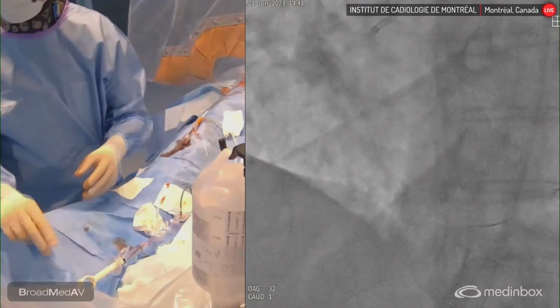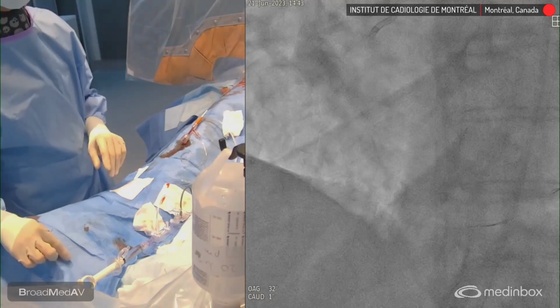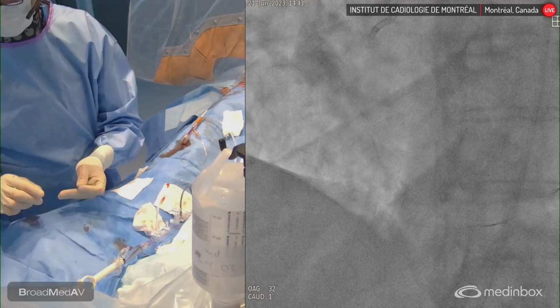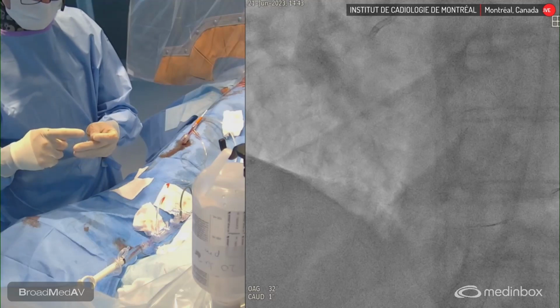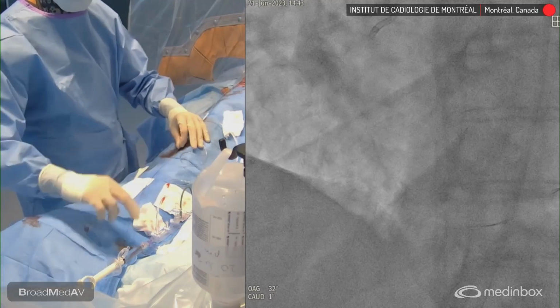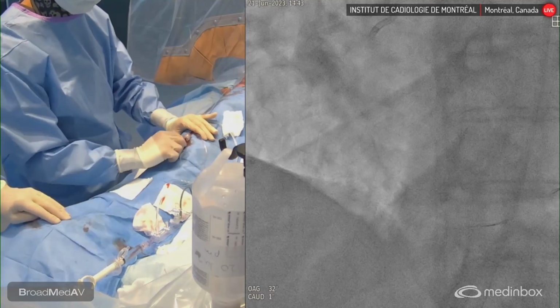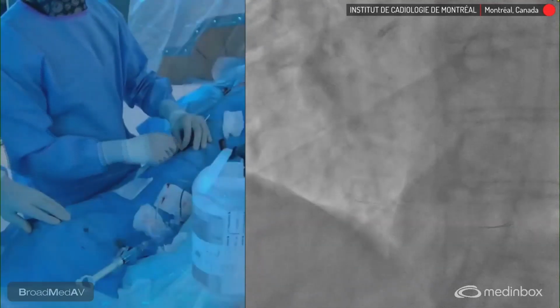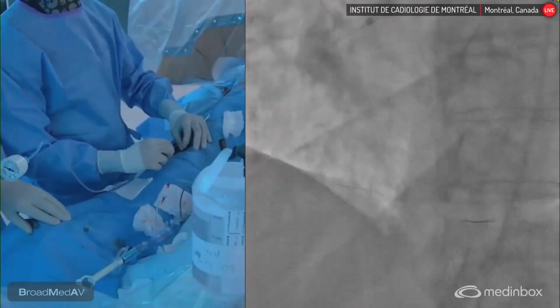And now I think we'll perform some dilatation with a 2.0 by 15 or 20 balloon before the IVUS, which would be helpful to bring down the IVUS. The information gathered while advancing the microcatheter is helpful because it's very unlikely we can actually bring the IVUS catheter without pre-dilatation here. So let's see how the balloon goes.